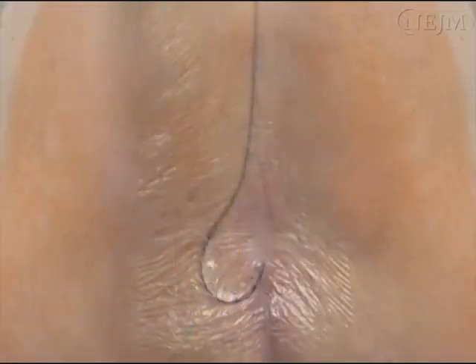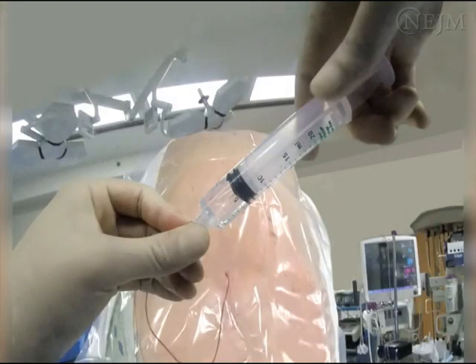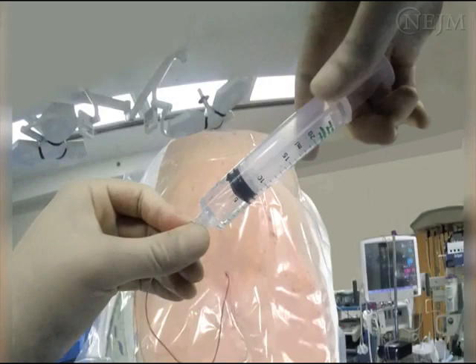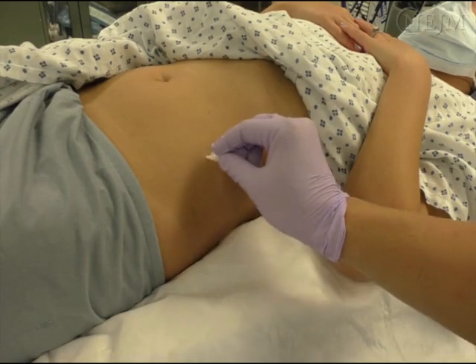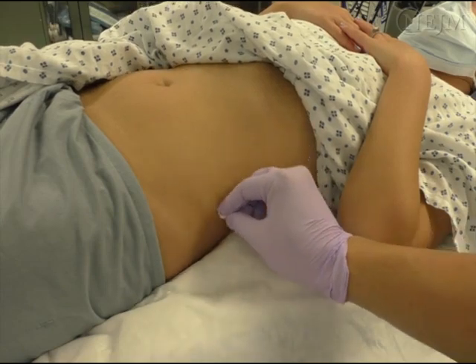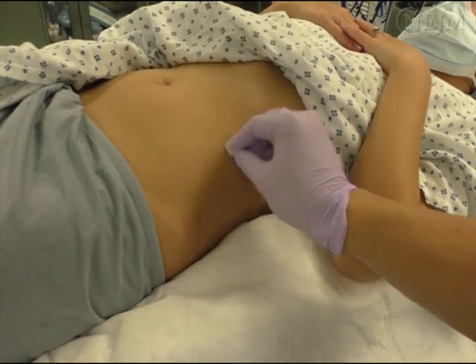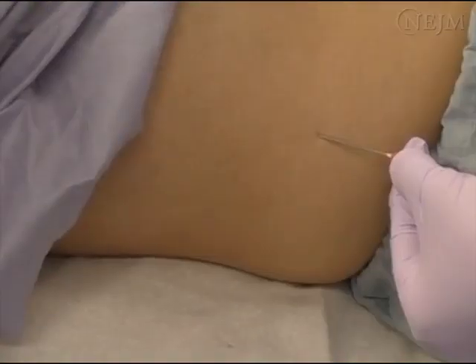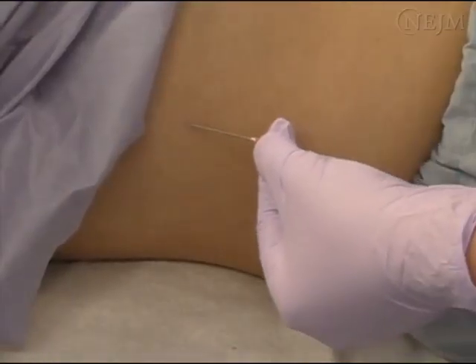Use sterile dressings to secure the catheter to the skin. Once a local anesthetic has been injected through the catheter, test its efficacy by testing for changes in sensation—for example, using an alcohol prep pad to test temperature response, or tapping with a blunt needle at various dermatomes to test for nociception.